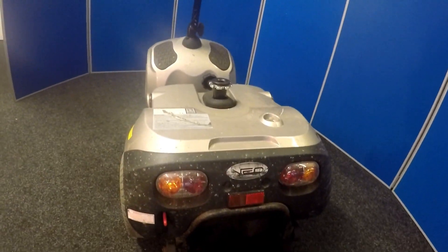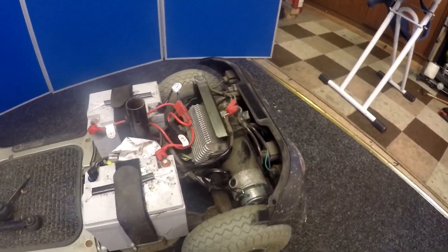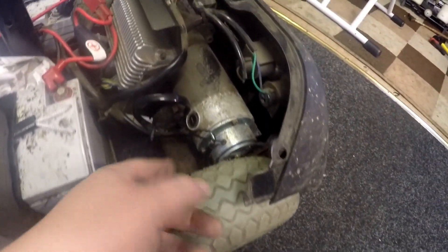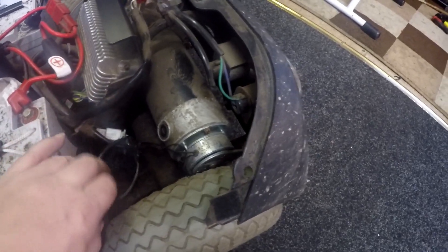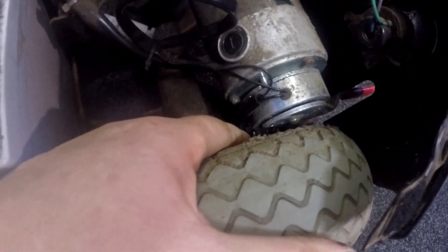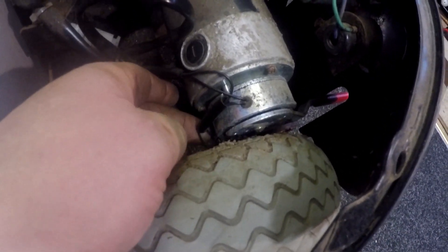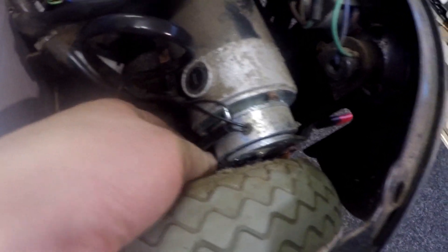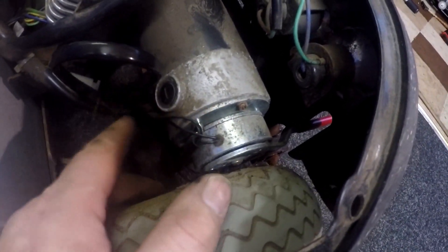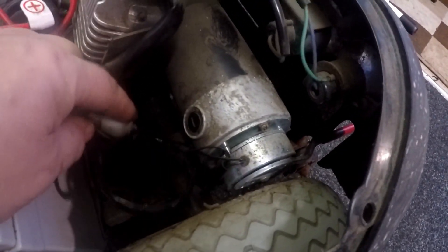I've removed the body panel along with the seat post, and I didn't actually have to take the wheel off because you can see the electric brake here. There's your motor, and the wires go to the micro switch down here. I always do a visual inspection on a scooter with a micro switch to make sure all cables are connected — sometimes a cable comes off the micro switch and that breaks continuity.